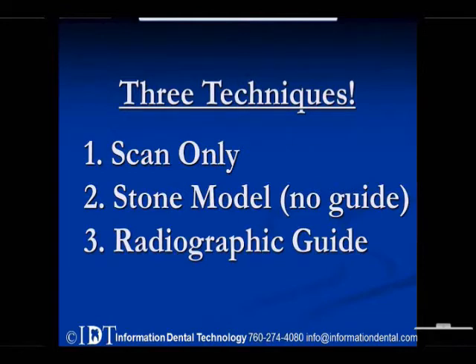And then the last one is the most commonly used one. This is a radiographic guide technique, and this one can be used on every single patient. You just have to build a radiographic guide prior to scanning the patient on the arch that you're placing the implant on.